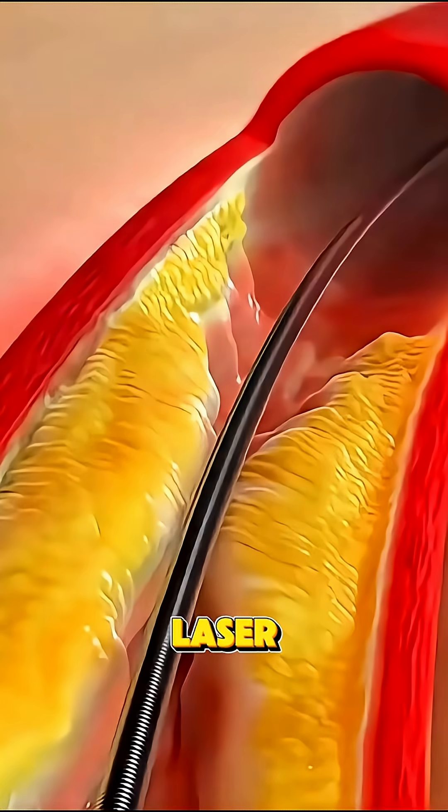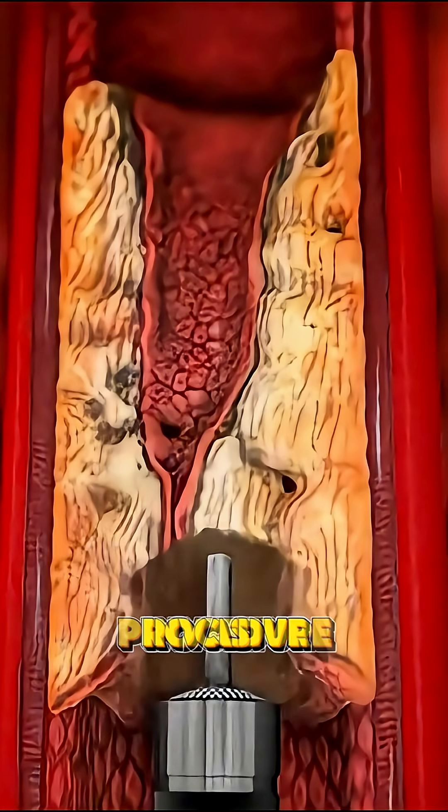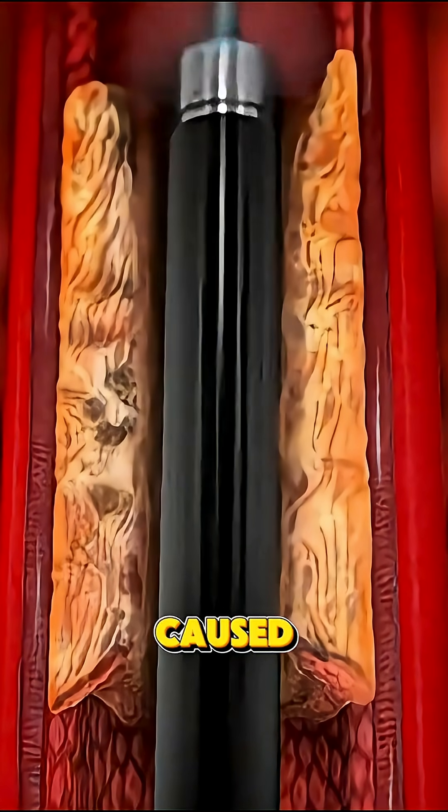Ever wondered how laser atherectomy surgery is performed? Let's break it down in 70 seconds. Laser atherectomy is a minimally invasive procedure used to clear blocked or narrowed arteries, often caused by plaque buildup.